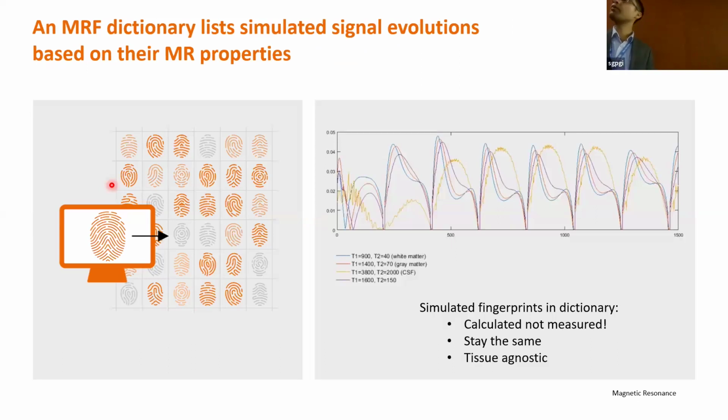So this is how it looks like. There can be thousands of possible combinations of T1 and T2 based on your tissue type and also based on your fingerprinting scheme. When the data is absolutely matched, which is already there in the dictionary, remember it is not dependent on your system imperfections or type of scanner, because it is calculated by an already available algorithm.